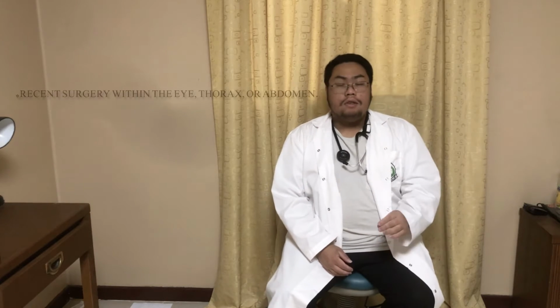Disclaimer: before starting your PFT procedure through the spirometry, make sure your patient doesn't have any of these contraindications. First of all, ask your patient if they've had a recent surgery concerning their thoracic area or their eye area. And then second, check if the patient is suffering from any cerebral, thoracic, or abdominal aneurysm. This might puncture the aneurysm area once they're performing the test.